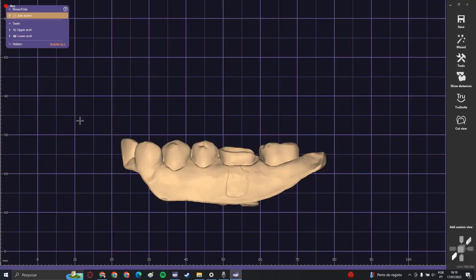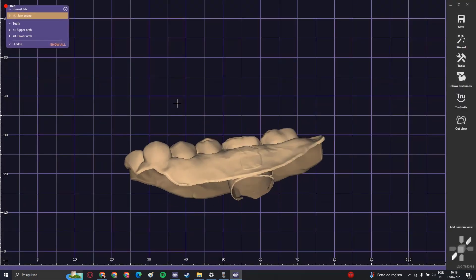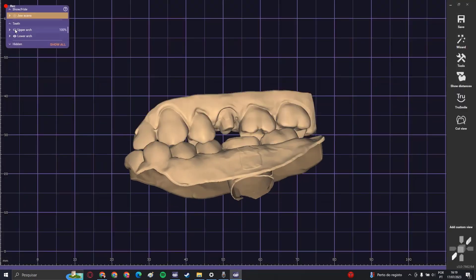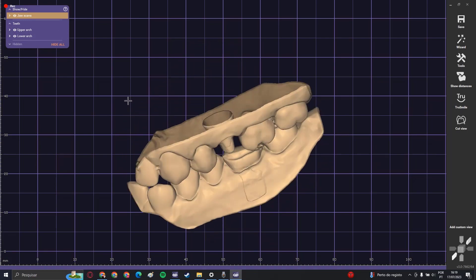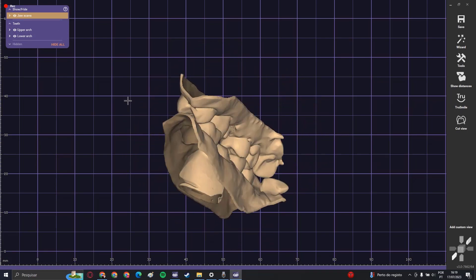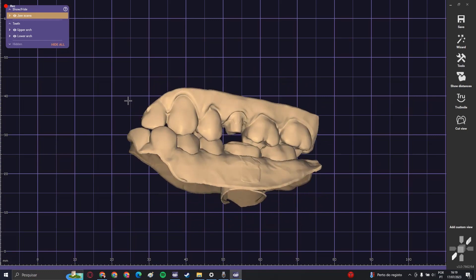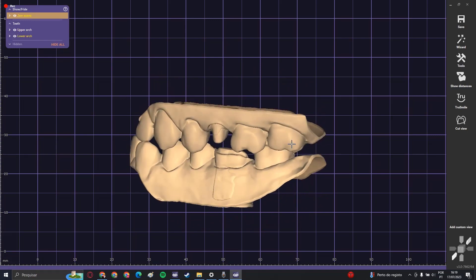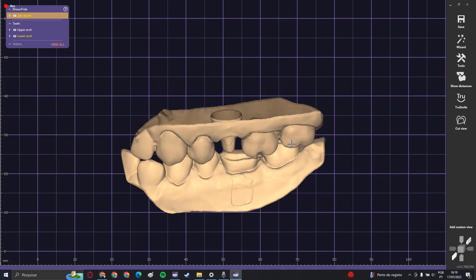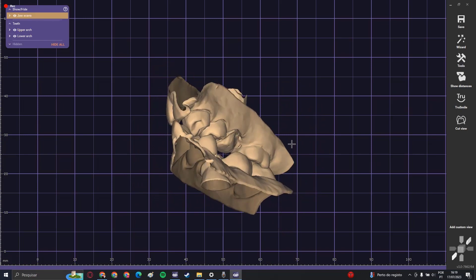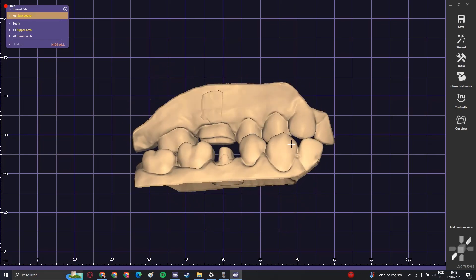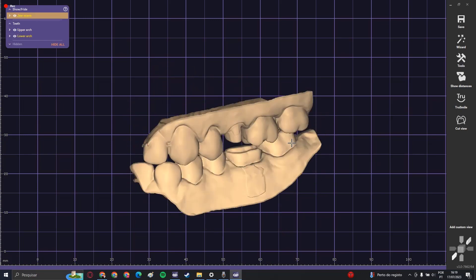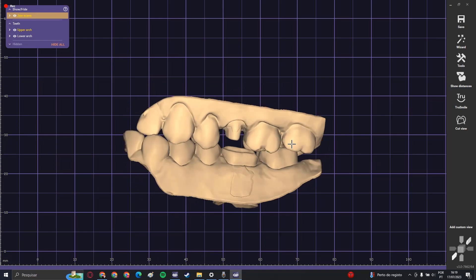That's it. Now you have both upper arch and lower arch in the perfect position, the correct position, and you can work fine and progress with your project.